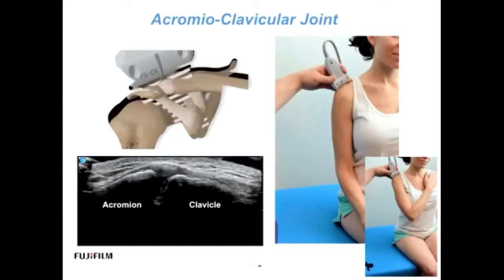It's very tender, and you want to use sonic palpation at this point. If you suspect something in the ligament or something deeper on the insertions of the ligament and that fibrocartilage disc, you may want to switch frequencies to the linear 19 megahertz probe that we'll be scanning with a little bit later if we have time. You can also stress the elbow by pulling down on the elbow and do kind of a weight-bearing exam on the AC joint. And that can be helpful for AC separation, just checking out the stability of that ligament again and seeing if the joint opens up or gaps.